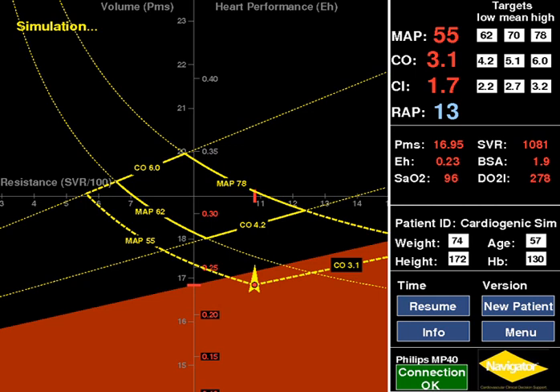The examination findings of poor circulation with low cardiac output and raised venous pressure suggest impending heart failure. A provisional diagnosis of probable myocardial infarction with cardiogenic shock is made. Angiography and echocardiography are scheduled and the patient is admitted to coronary care. Anticoagulant therapy is commenced. Continuous cardiac output is measured from the radial artery catheter using a LiDCO monitor, which is connected to Navigator. The patient status shows his current MAP of 55 and CO of 3.1. His RAP is 13 and can be found in blue in the upper right data pane.